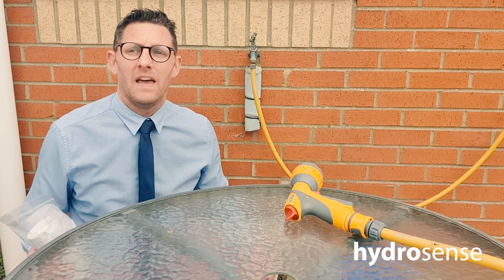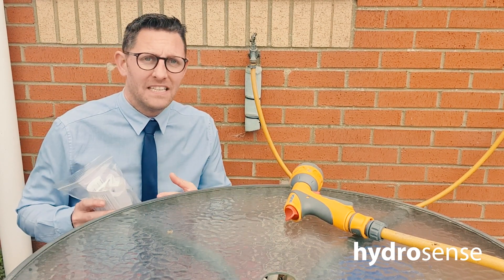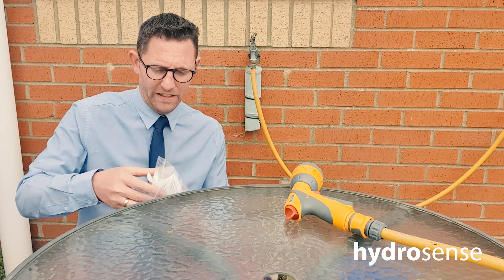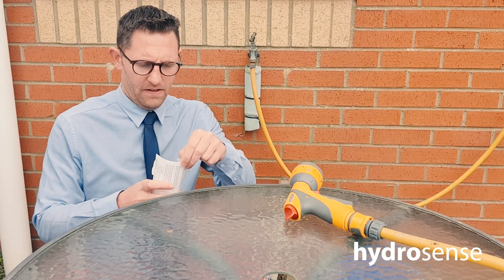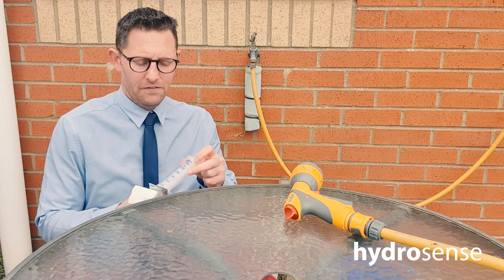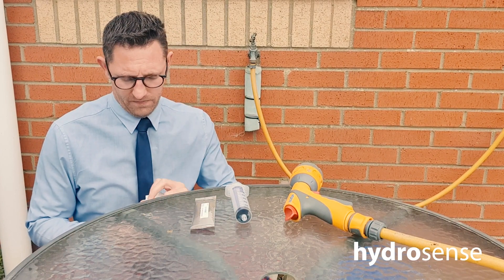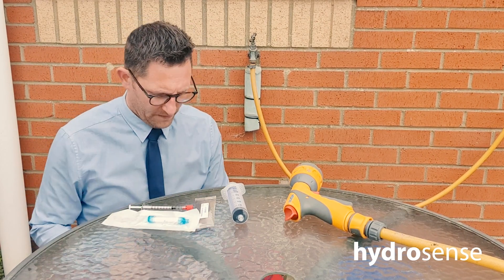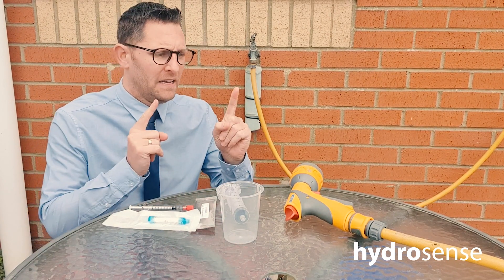Here we are with the HydroSense single syringe test kit. The kit contains everything needed to carry out one Legionella test. Opening it up, we have the most important thing — the instructions — we have the syringe, the HydroSense test strip, the filter, buffer solution, and a beaker.